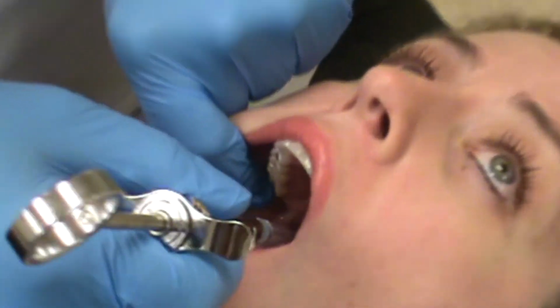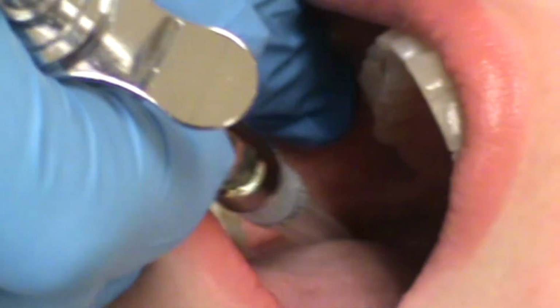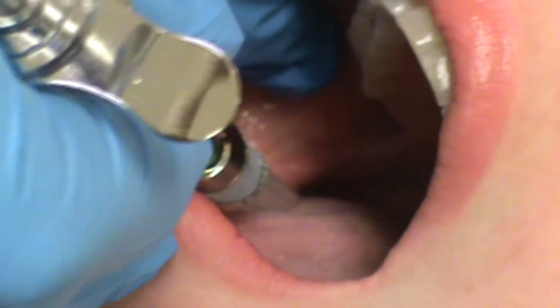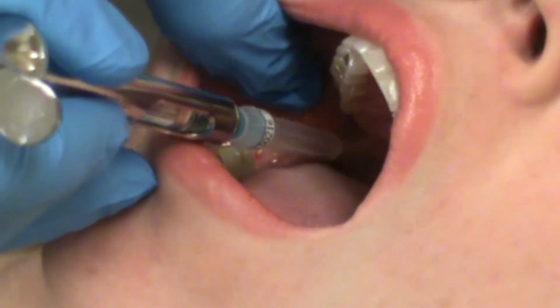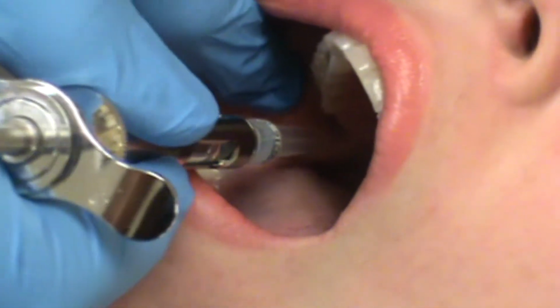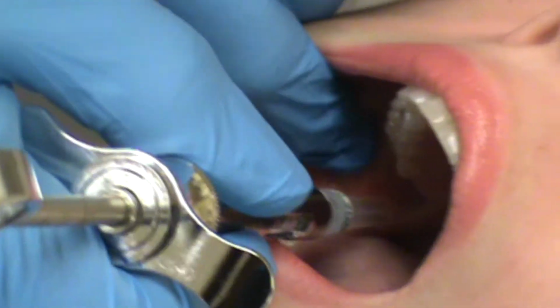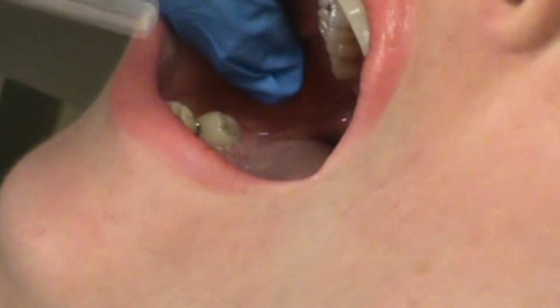Then the lingual nerve drops off right on the inside here, on the inside aspect of the pterygomandibular fold. So when we go back to do the lingual block, we go back to the same site and don't go back quite as deep, maybe a half or so of the depth of the needle, maybe even a little less, and you deposit about half a carpule, and that will numb up all of her lingual gingiva to the midline.